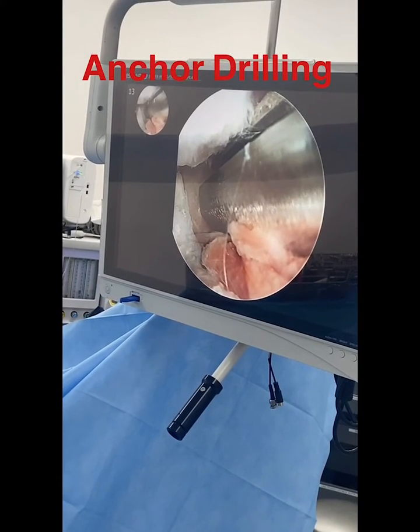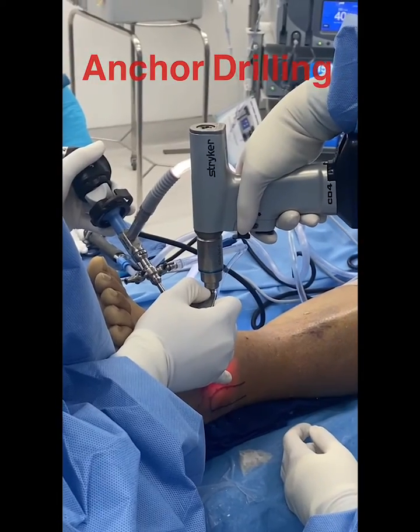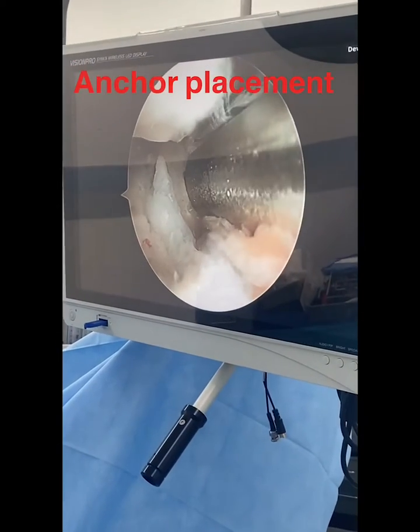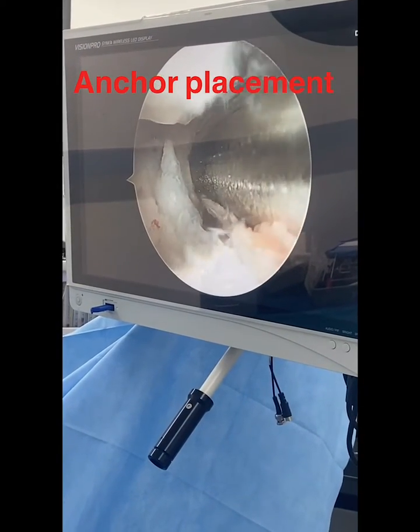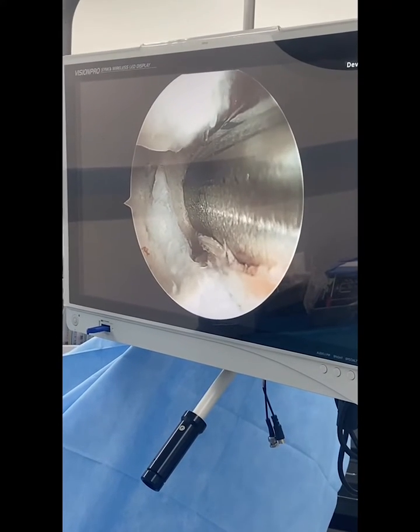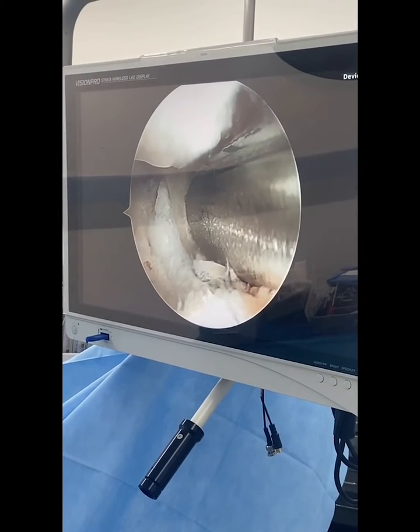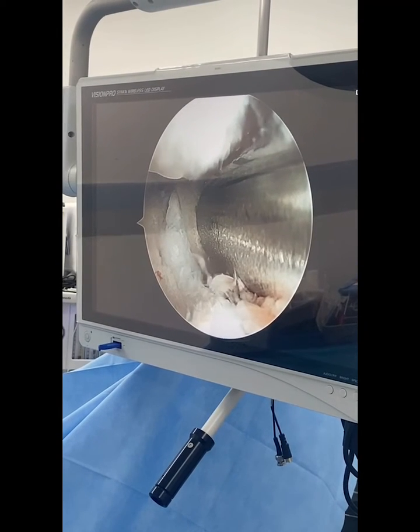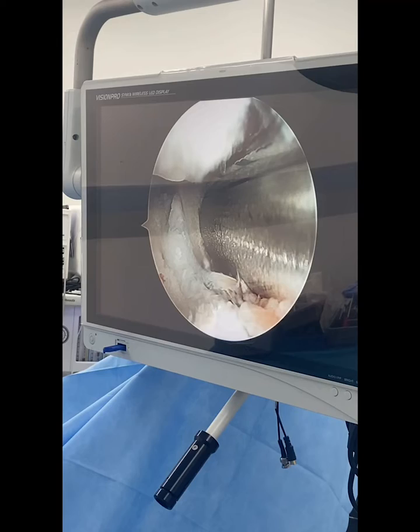Then I take a drill, and I drill into the anterior aspect of the fibula — that's how I seat the anchor down. Once the anchor is seated nicely into place, I take the sutures from that anchor and run them out of the distal lateral aspect of the foot. This is all done in a percutaneous fashion to allow for a very small incision and for a faster recovery.